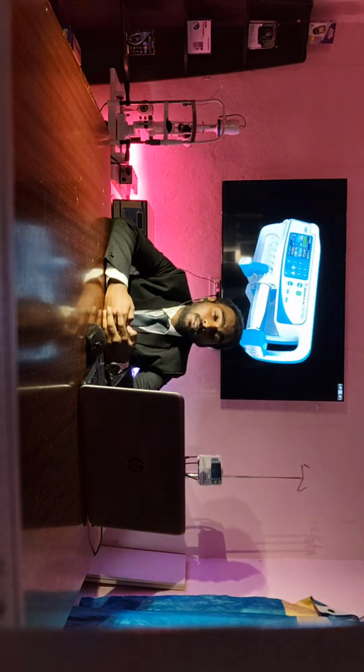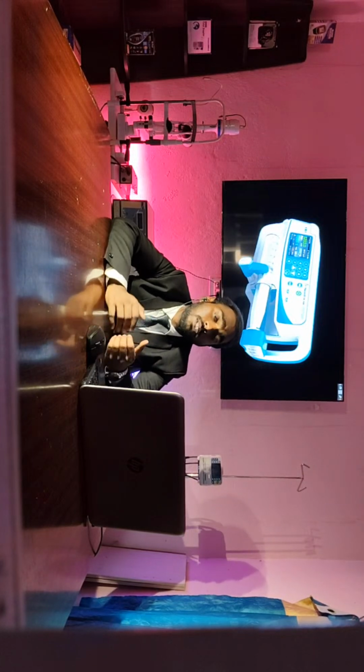So when it comes to the syringe pump, the dosage will be in the higher manner and the volume will be in the lower manner. So here we are able to use drugs like heparin within 60 ml of volume. These kinds of drugs we can use through this syringe.